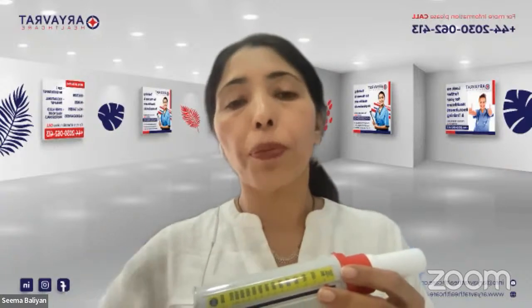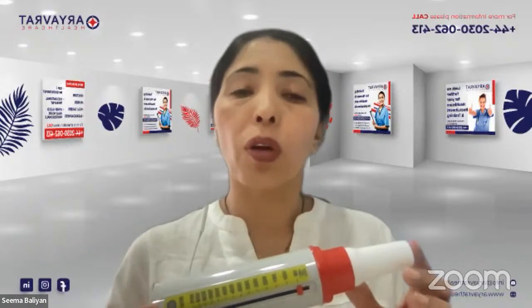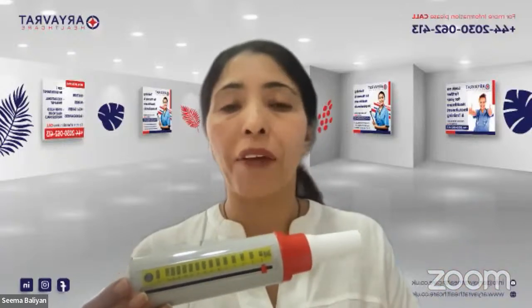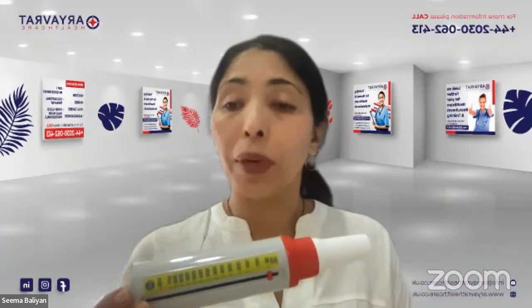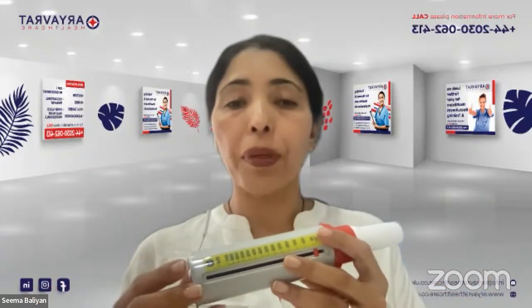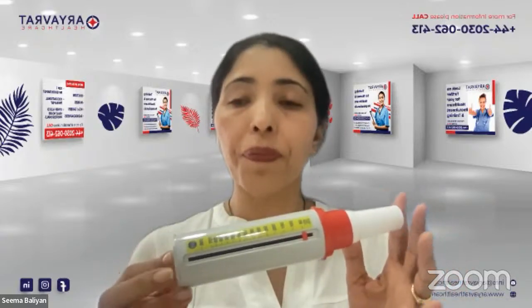So the higher your peak flow is, that means that your lungs are not congested, your lung capacity is more, you are able to breathe better, and you are not having any problems related to asthma, or your asthma is under control. So these are the two, we have set our purpose, and we know what peak flow is and why we are using it.